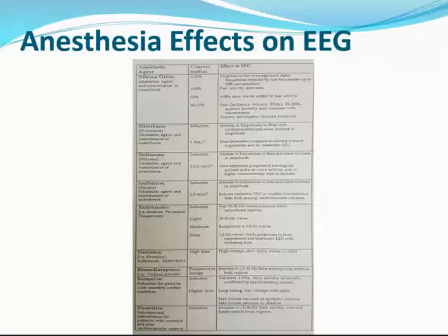a disadvantage, should I say, because they do. When you have a patient on muscle relaxation, it removes movement artifact from your EEG, which is very good. But sometimes you want them to be able to move their eyes, and you want everything to be included together so you can get an EEG activation in place. You can only use muscle relaxation, of course, for patients who are sedated and asleep, under anesthesia.